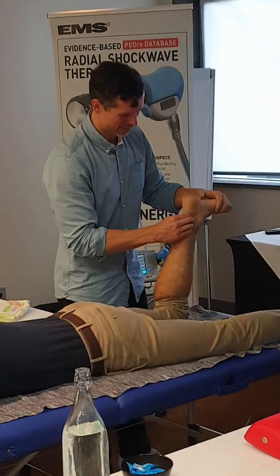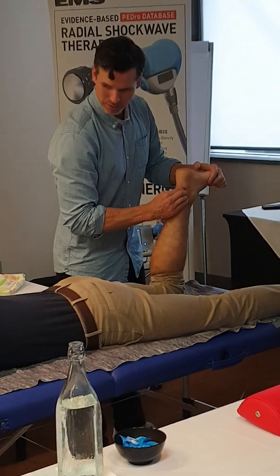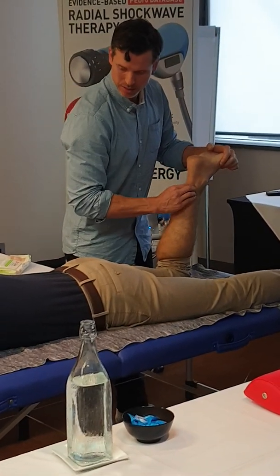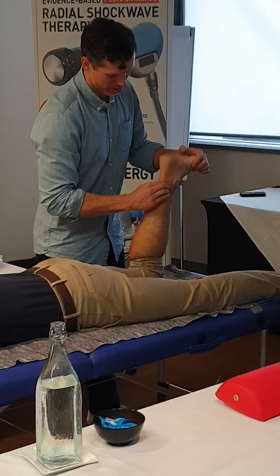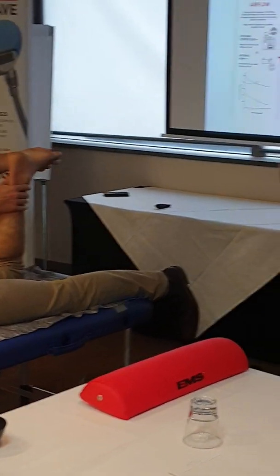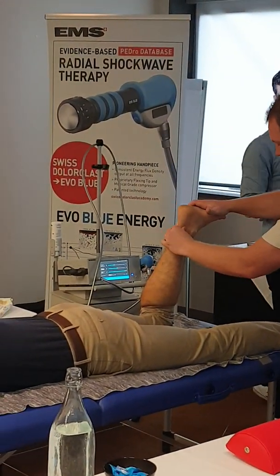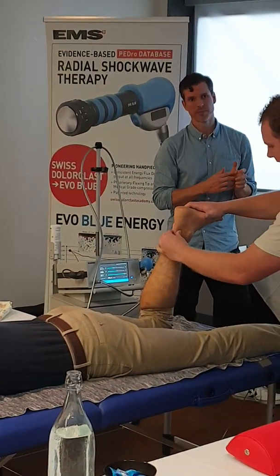I guess not. You can see the nice pinkness in the area too. How's that feel when I do that now? Yeah, good. Still tender. It feels a little less thickened, if you guys want to have a feel. Not hugely, but it feels a little like we moved some fluid and stuff out of there.